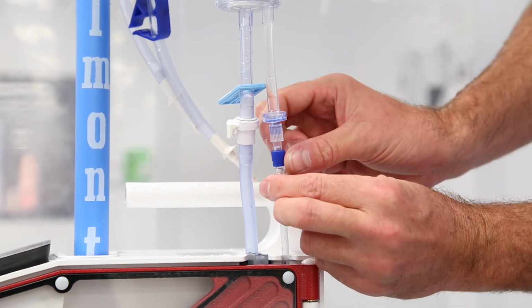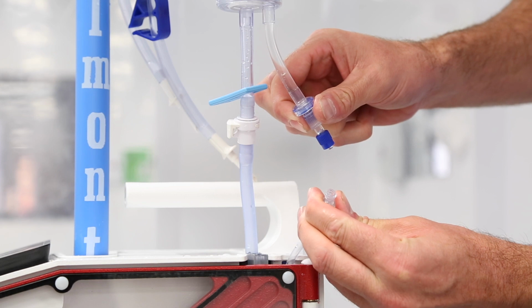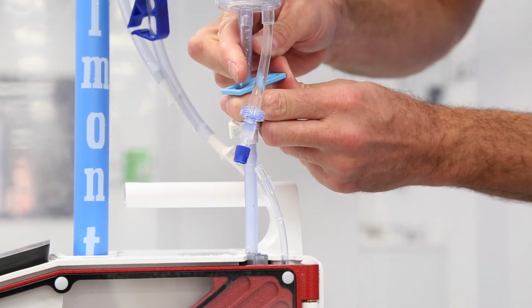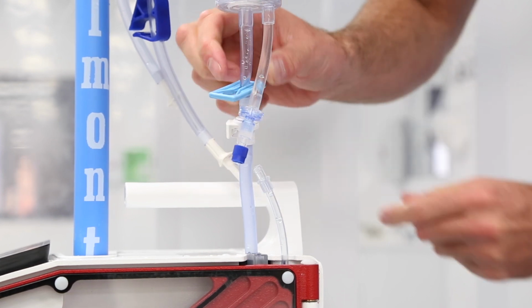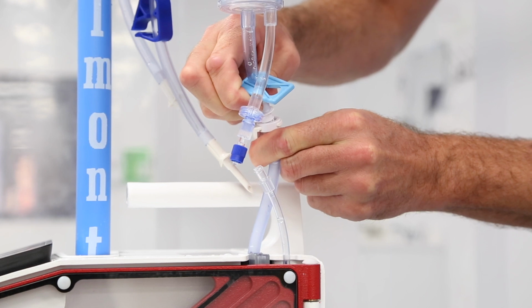Disconnect the small reservoir by unscrewing the lower fitting on the recirculation line. If the small reservoir contains fluid, close the blue clamp to prevent a spill before disconnecting the fluid line. Disconnect the fluid line by pressing the quick release tab while separating the fluid tubing.